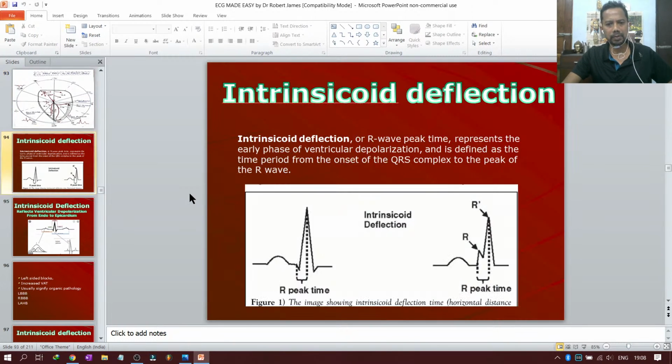So this is about the blocks. And now this is also important. This slide should actually have come before these 2-3 slides which I discussed just now. Now this is very important, and many of the times we ignore this.